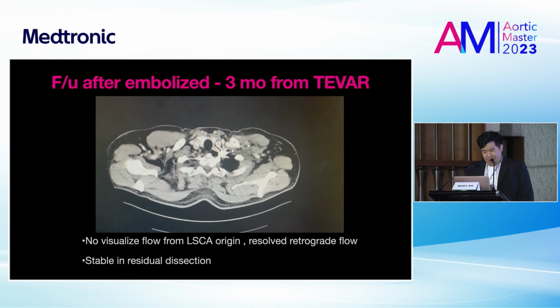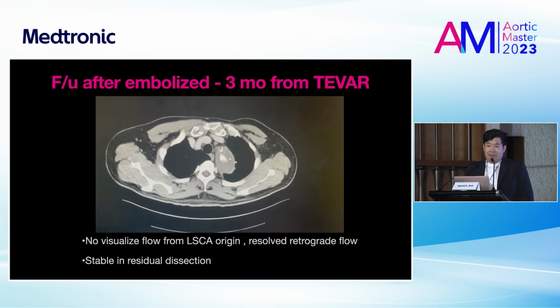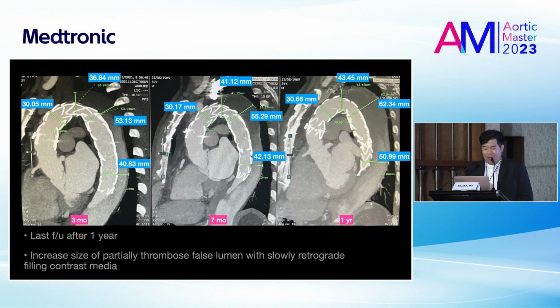So we did the embolization again on the left subclavian, and after that the CT showed no type 2 endoleak from the left subclavian at all.